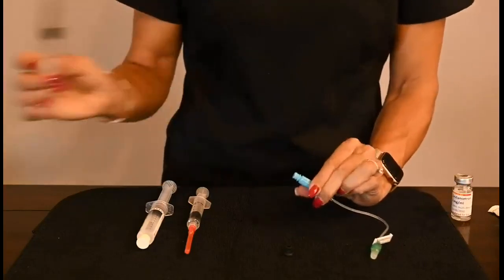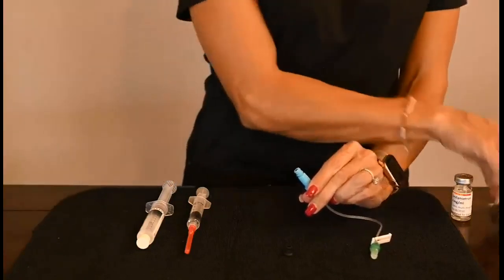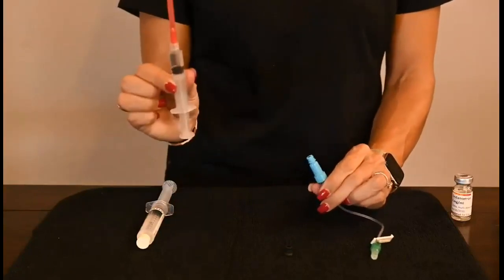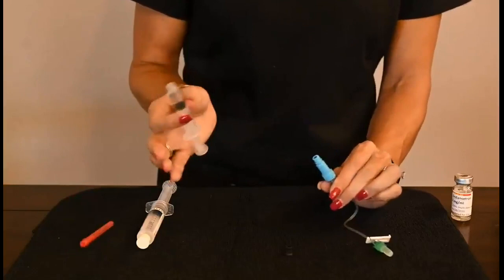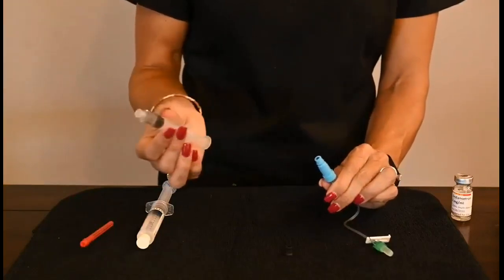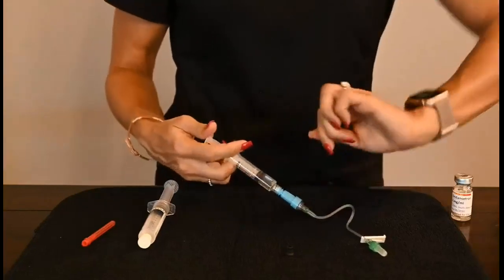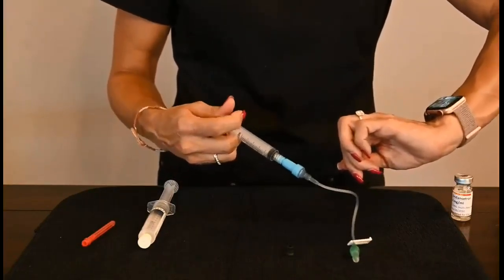And I'm going to take this off. Check your facility policy to see if you would need to get another alcohol pad to clean for 15 seconds. Then I'm going to get my medication. Now, just for time purposes, I'm going to say that I need to push this medication over 2 minutes. I would come over here, I would get my watch, and I would, over 2 minutes, push the medication.